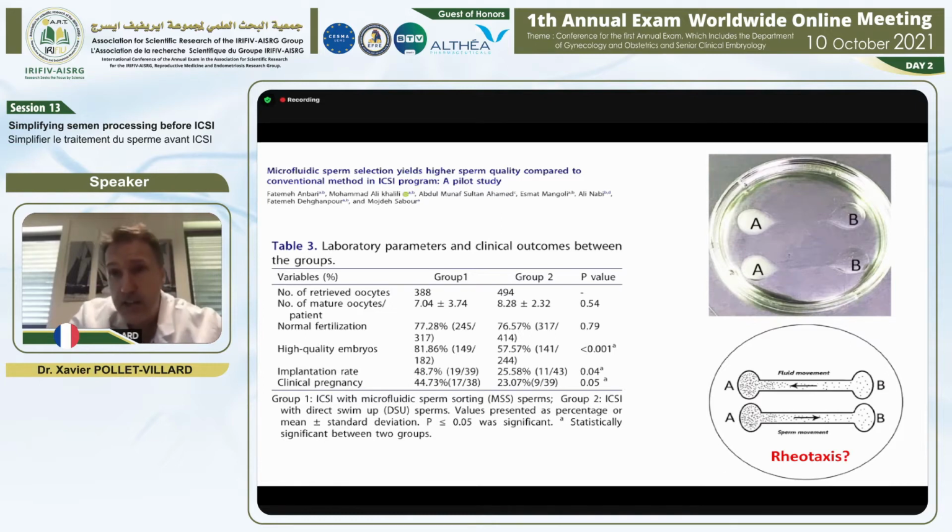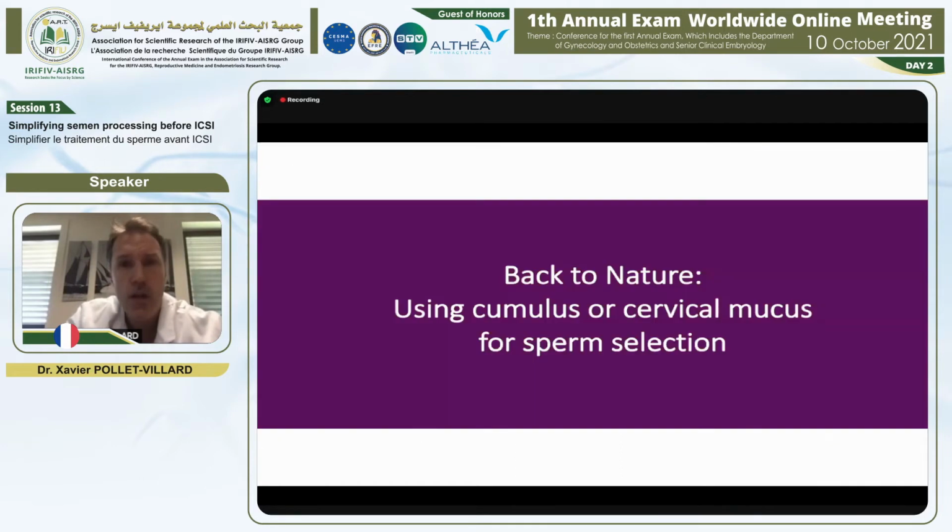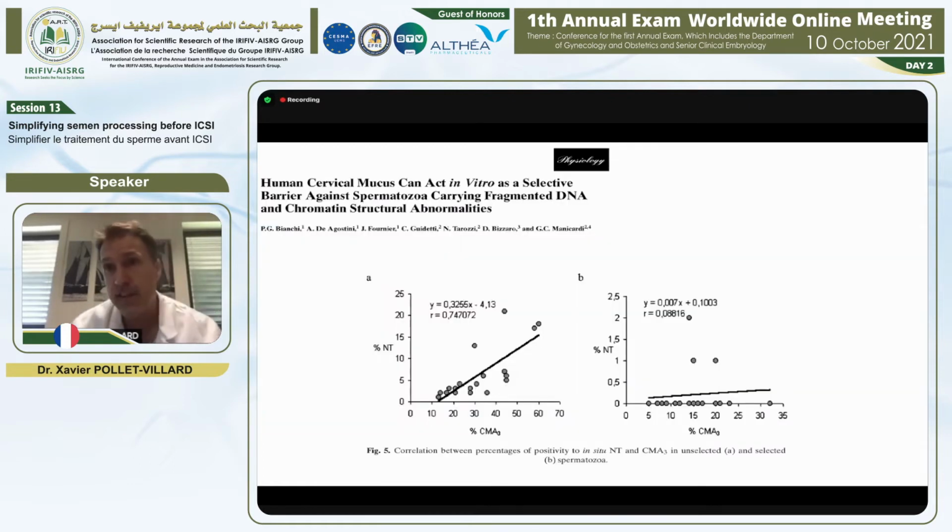Okay, so what we can say from this study is that it can improve the embryo quality and maybe sometimes the clinical pregnancy rate, the clinical outcomes. So what can we do to avoid centrifugation? We could also use what nature put there for us to use. For example, we could use the cumulus or the cervical mucus for sperm selection. And we can do it in an ICSI dish.